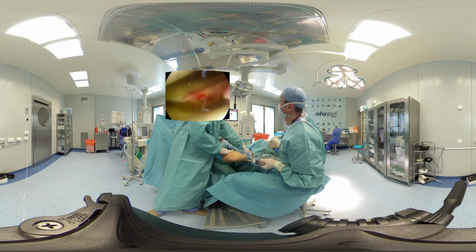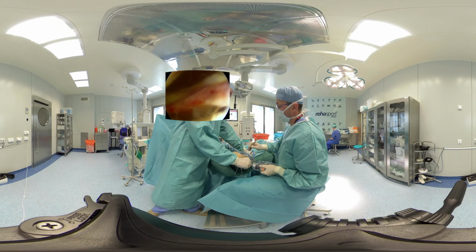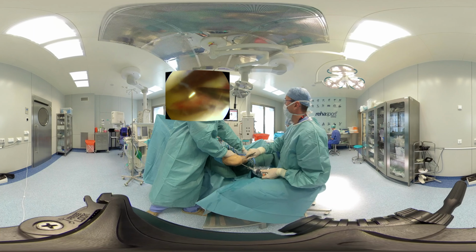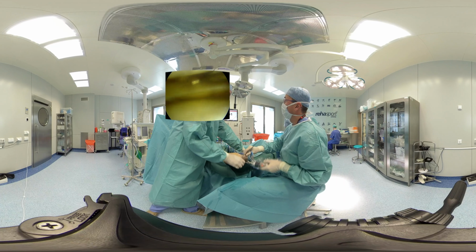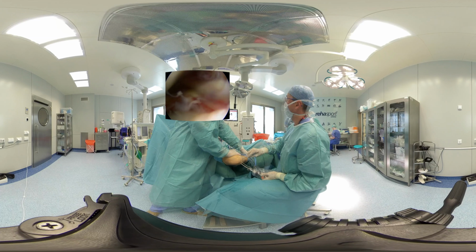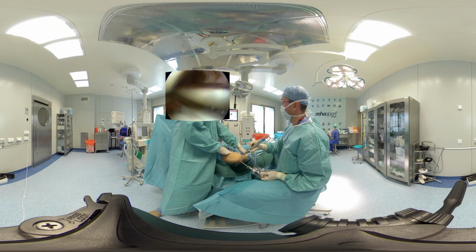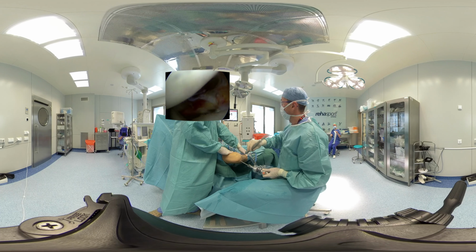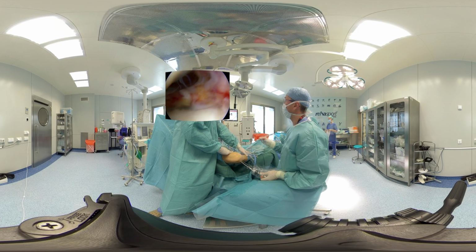In the lateral compartment, we can see the detached part of the posterior root of the lateral meniscus covered with the newly formed scars from the hematoma. First, the debridement and checking with a hook whether there is also any other damage.